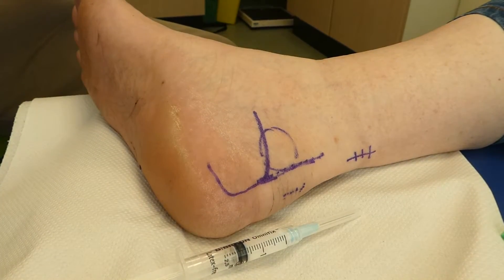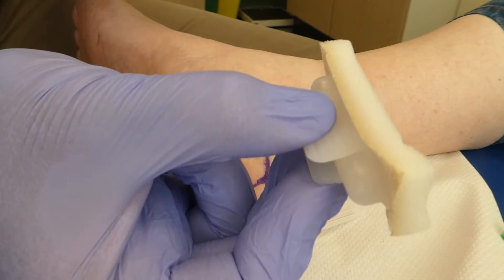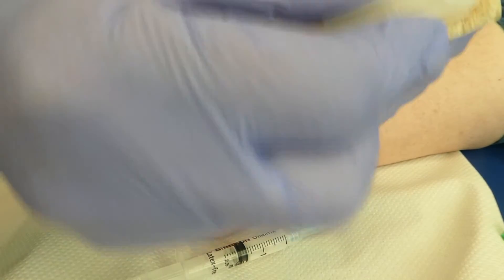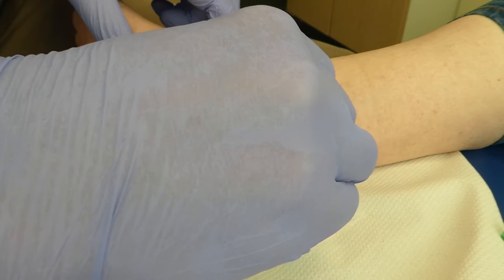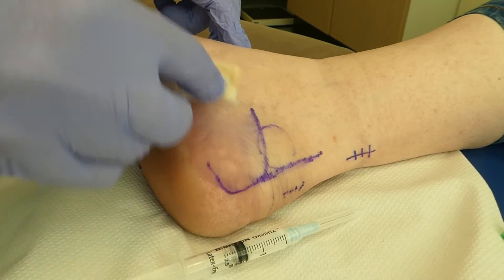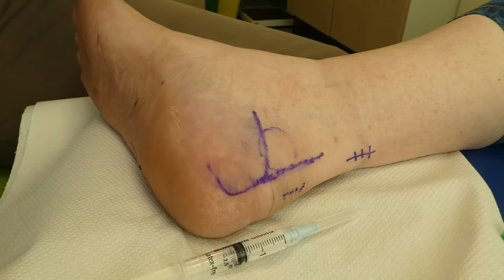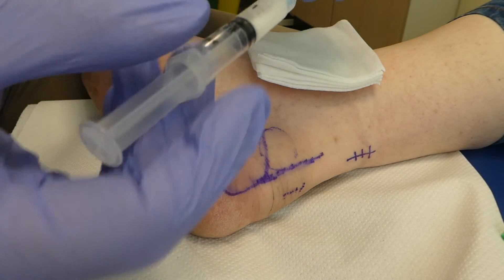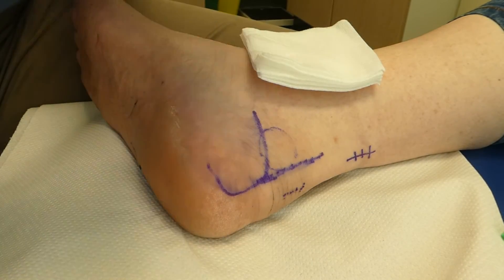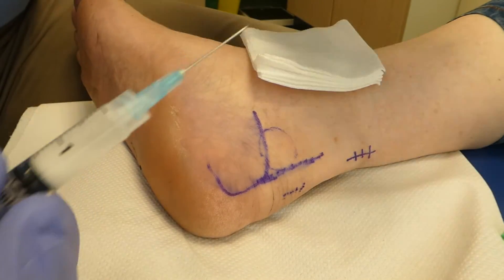Bit of skin prep. These are the chloropreps that I like — a little snap breaks the seal. I normally get them going on the back of the glove and then clean the skin. Off to one side. Going to get some gauze — there can often be a little bit of bleeding, so gauze to hand. You can do this under ultrasound guidance if you're not sure where the bursa is, but we're really happy with this.